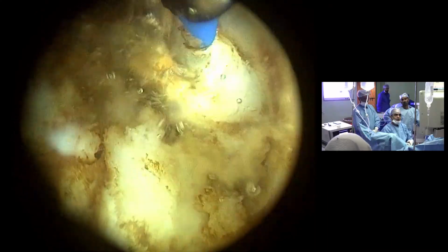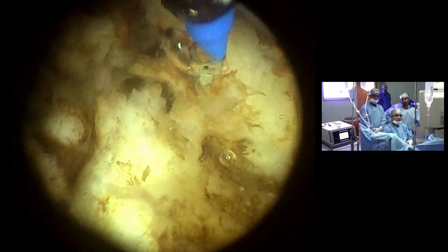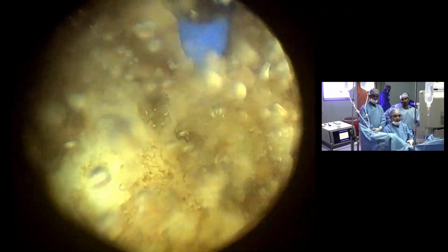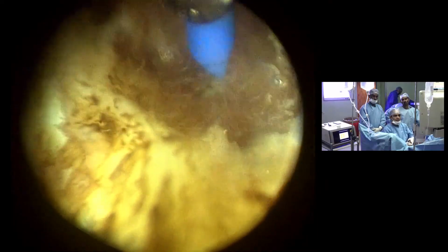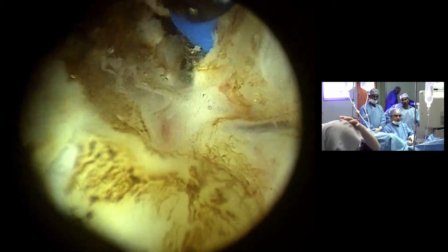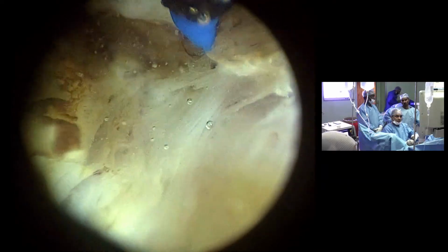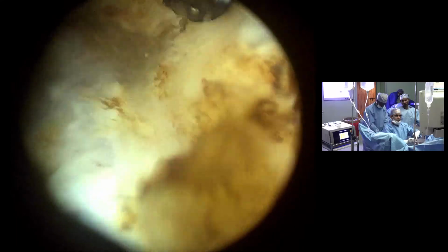So things are moving ahead for India where people are shifting to enucleation. Otherwise, green light laser has been popular in the US because of other factors and because of the ease to do it. But per se, it may not be that great looking at the current lasers which we have. Right, sir. Thank you.